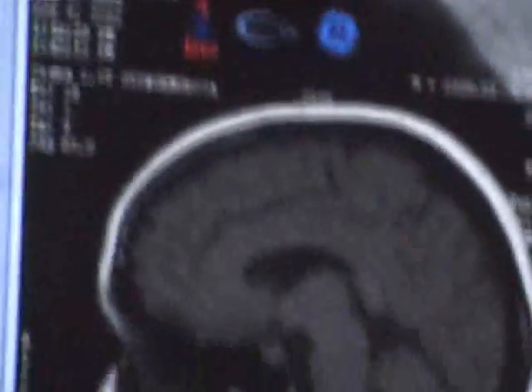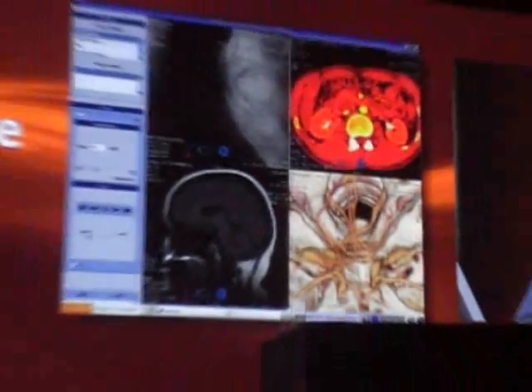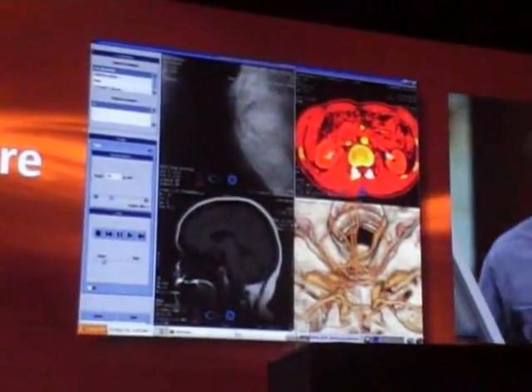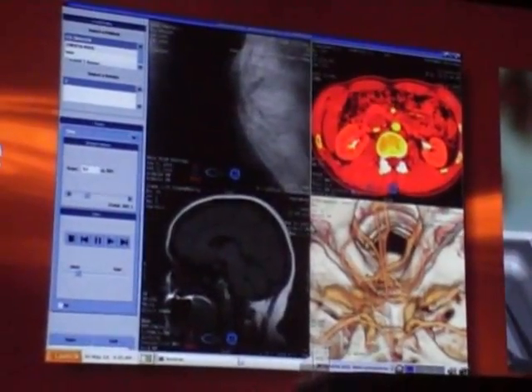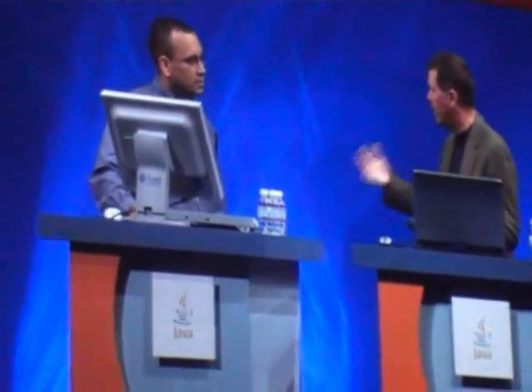You're not hiding any supercomputers, you're not hiding any code? No, it's all Java-based. It's actually using some of the new features of the upcoming Mustang release, and the Java bindings for OpenGL API. We're very pleased by its performance and the raw computational power that Java gives us. So again, coming off the digital divide conversation, how can we do this remotely, and how can we export the knowledge and the expertise over the network? Is it possible using this?